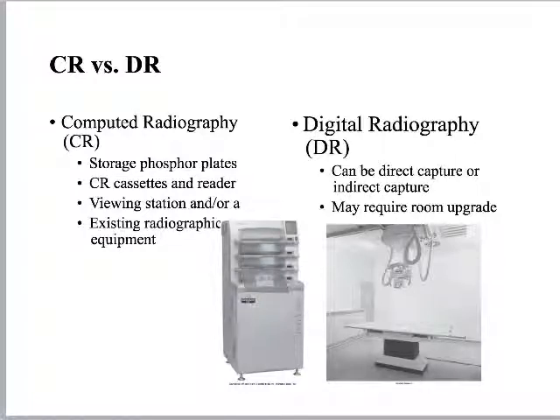So let's define conventional radiography real quickly, just as a subset. We're talking about film. Anytime I talk about conventional radiography, I remember the days when we had a film screen combination. You would stick the film in a dark room. You would stick the film inside of a cassette that had 2 intensifying screens inside the cassette. You would put that cassette inside of the Bucky tray or whatever you're trying to take a picture of. If you're in a radiation therapy suite, you essentially would insert the cassette into a holder there in the therapy suite, and you would take your picture.